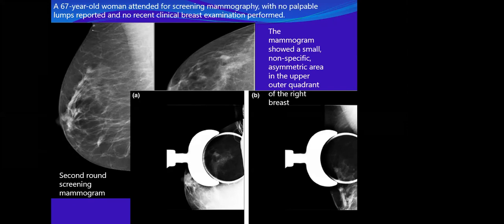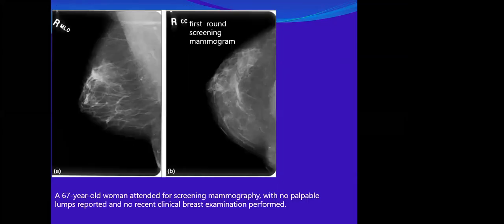We just finished discussing the importance of previous mammography. We should always ask about the previous mammography and compare with it. It's not in the system, and we have told the patient always to keep her mammography with her. If she's coming for a new study, she has to bring all her previous mammography with her. So we need to compare it with the previous.